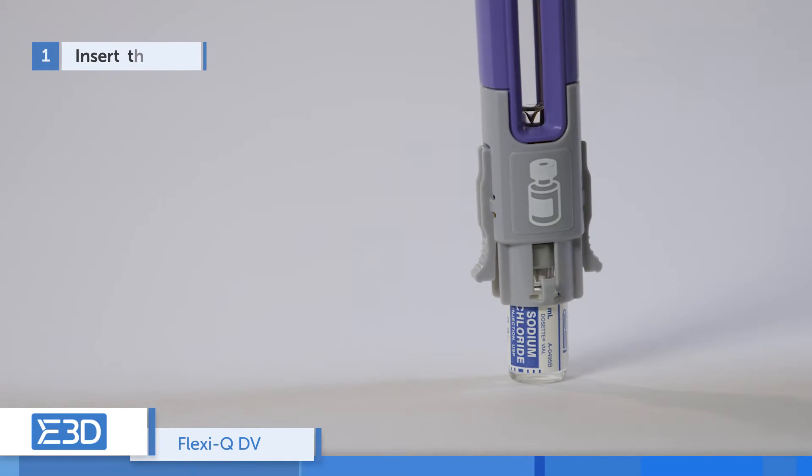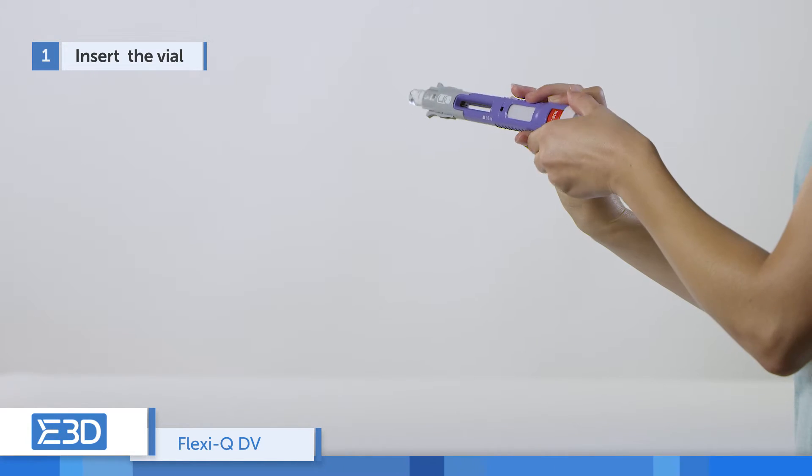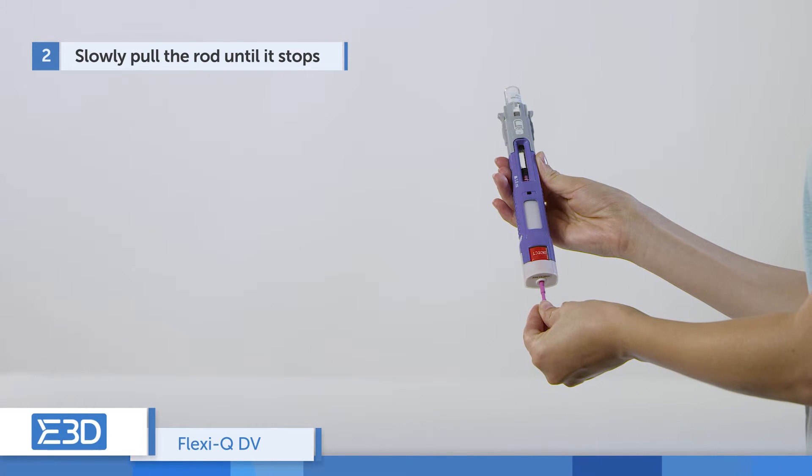Hold the device on top of the vial and press inwards. Slowly pull the rod downwards until it stops.